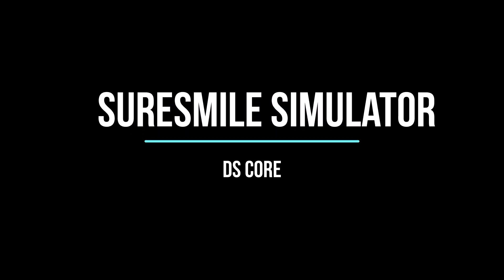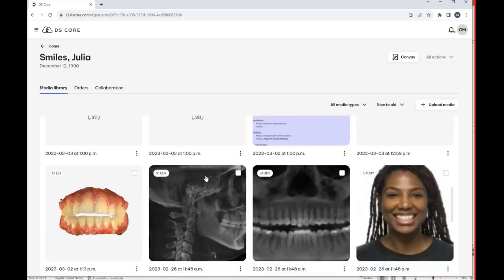Hello and welcome. Today we're going to look at the SureSmile Simulator that is now a part of DSCore.